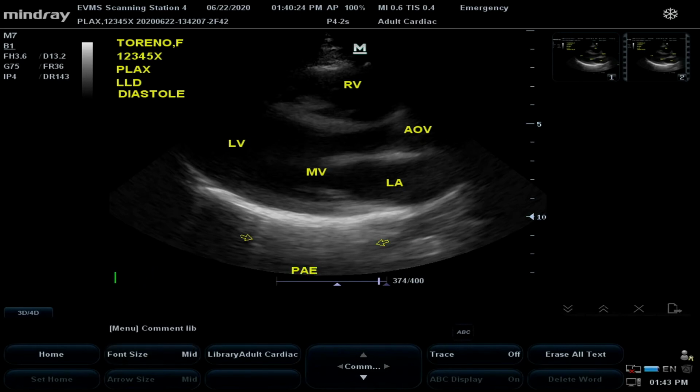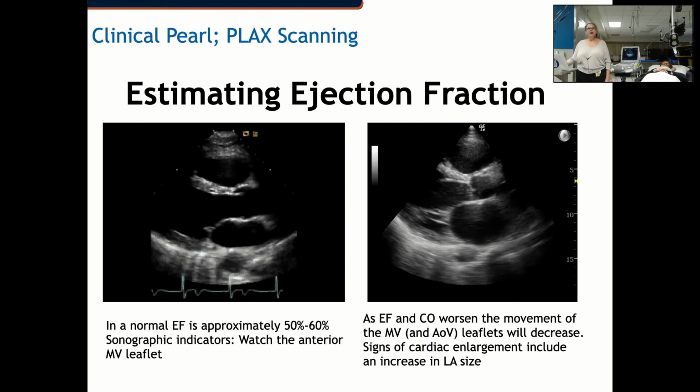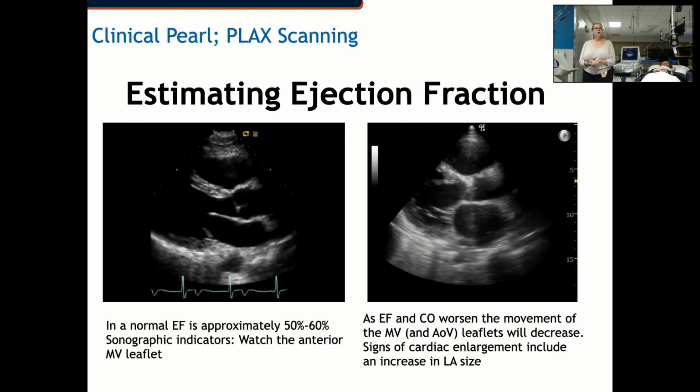And so now all the requirements for the lab are labeled, and we are going to go back to our computer and finish this section of notes. So I'd like to give you a clinical pearl.